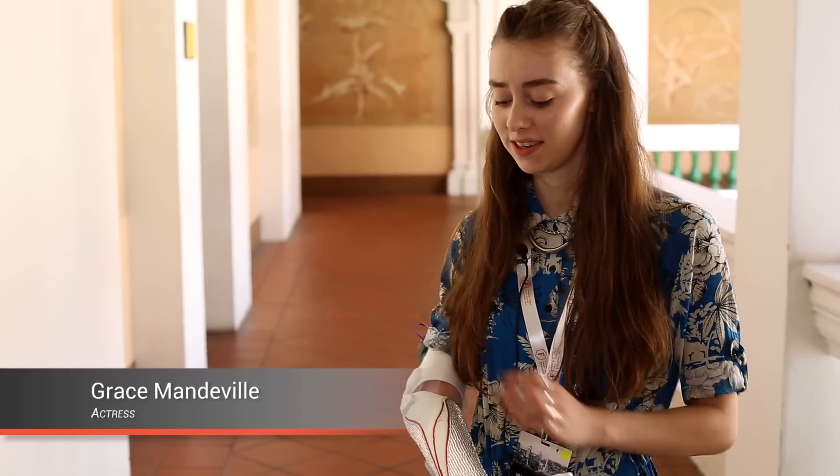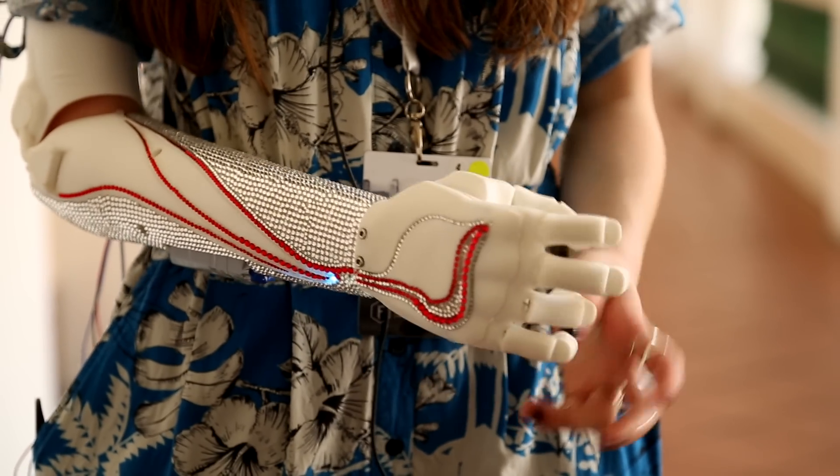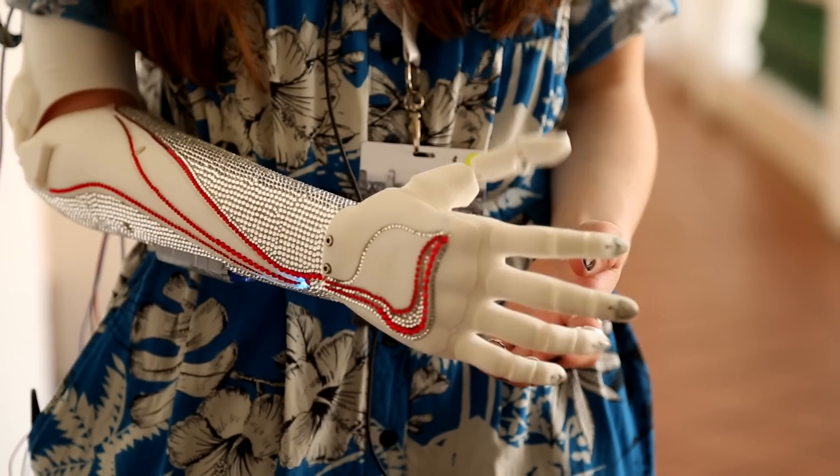I've always said that I don't like wearing normal prosthetics because they look like normal hands. They're bulky. They don't do anything. They just make you blend in, and I'm not interested in that at all. I think differences should be a good thing — you should make them look cool and they should reflect your personality. You shouldn't try and look like everyone else.